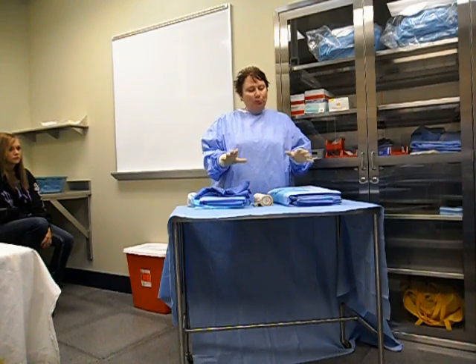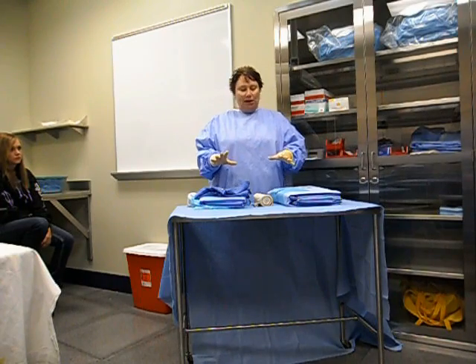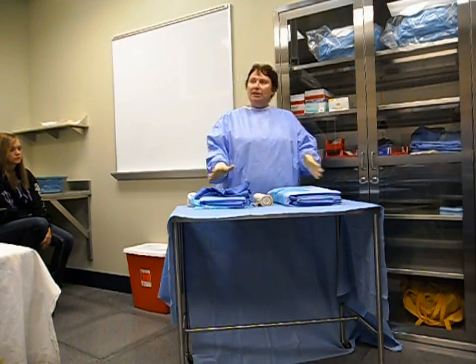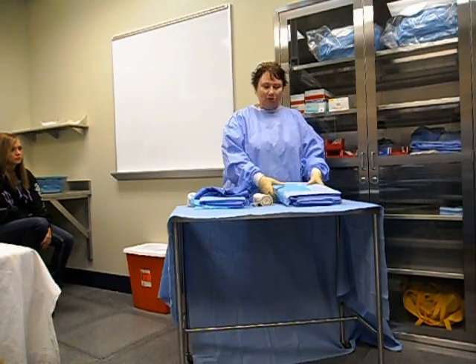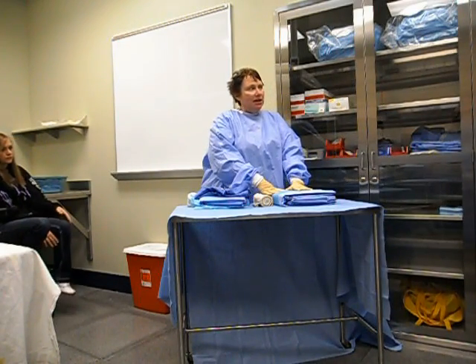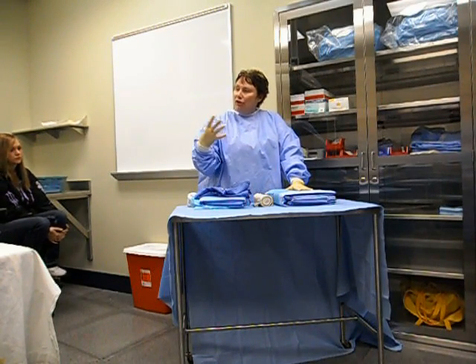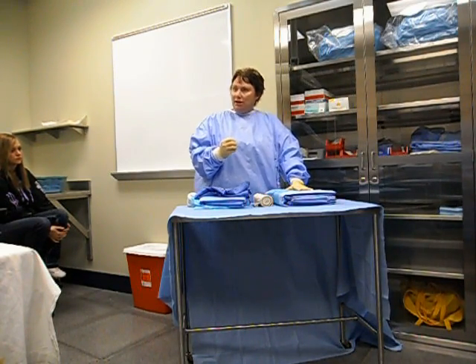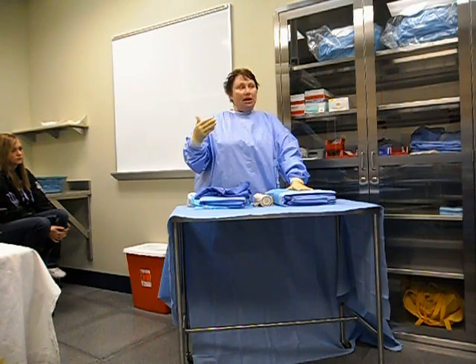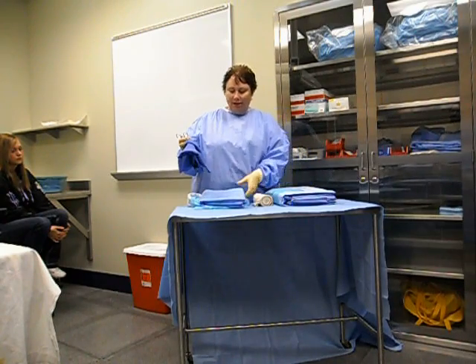Once again, we put the drape in the sequence the way we would have it for the patient — the last thing on is the first thing you put on your table, so your extremity drape. And really, all this is is like a laparotomy drape, only the fenestration or the hole is in a different spot, and the drape covers the entire patient.